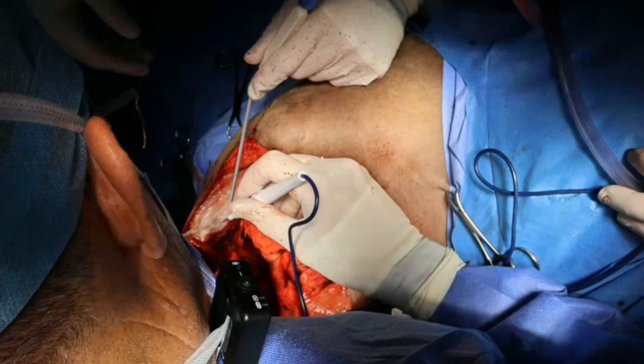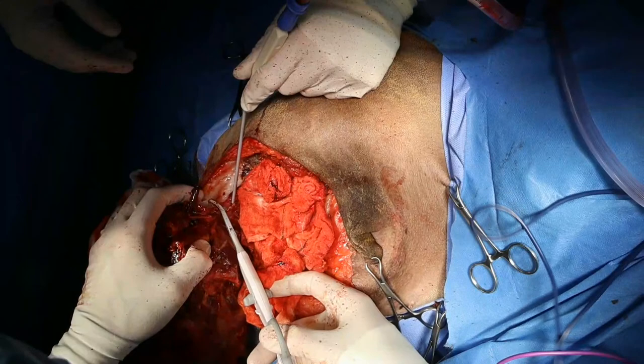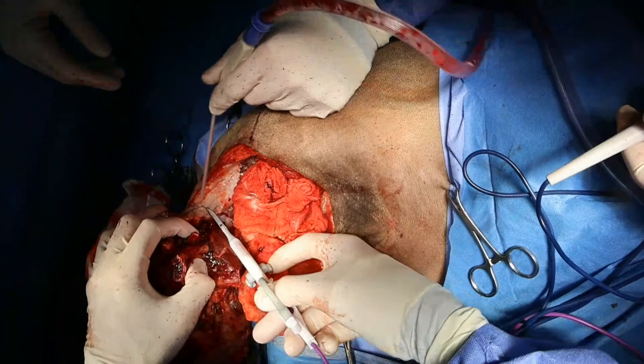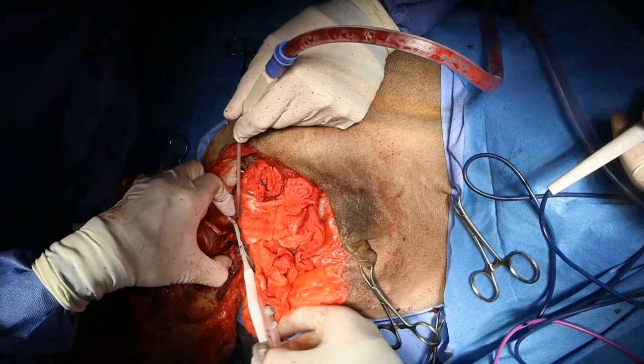You can't get lazy and impatient at this point. So I've nearly got it off. I'm going to hurry up now. You have to make sure that you take your time and ligate all those vessels. There's a tendency to get to this point and just be like, buggered it, I just need to get this leg off. I'm getting bored. And you have to make sure you slow down.